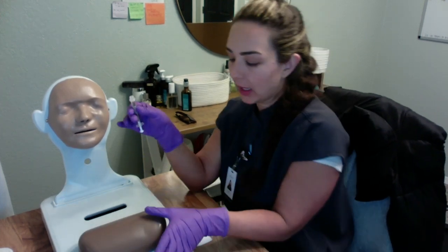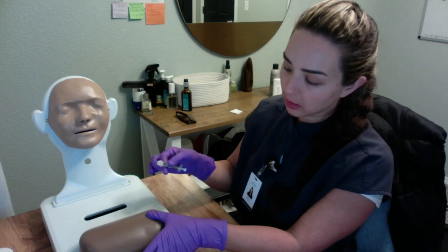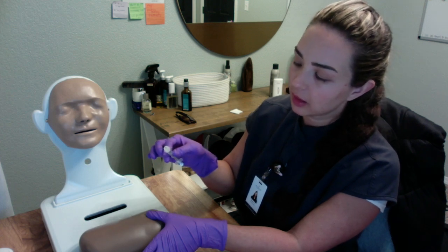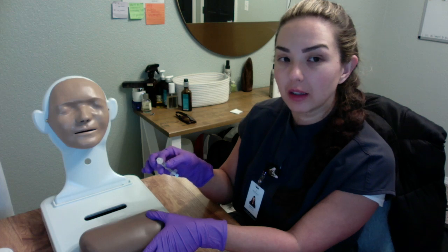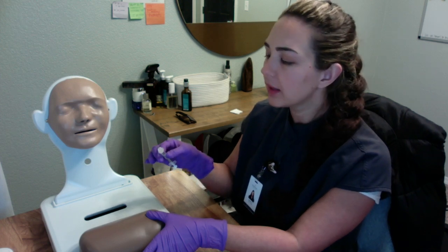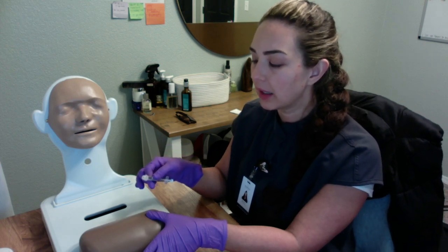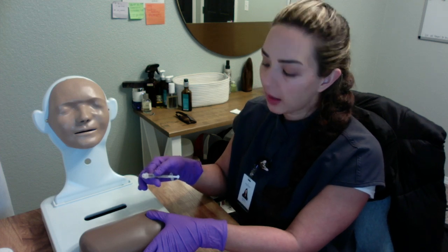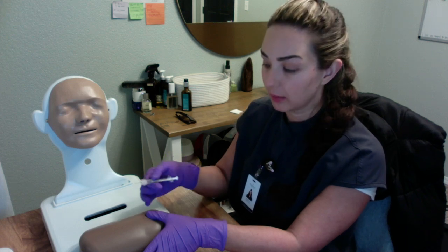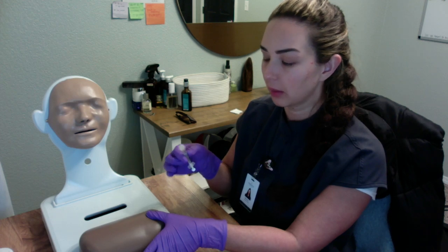So we're going to go ahead and put our thumb here and stretch the skin slightly, and then we're going to go ahead and administer at a 5 to 15 degree angle to administer the medication. Now, I will say, when I was practicing this, I feel like in a real life setting, I would not probably go as deep as what I'm going to go on this patient, but in order for me to get the medication administered, I have to go probably further than that.